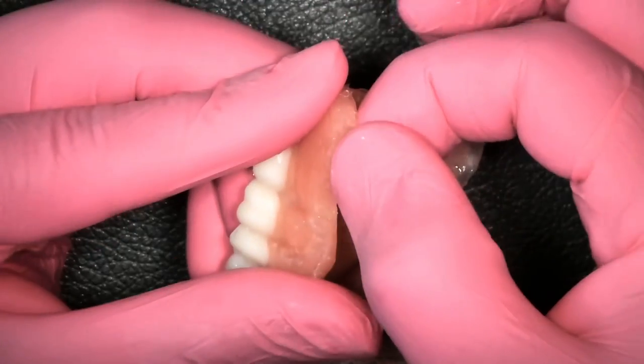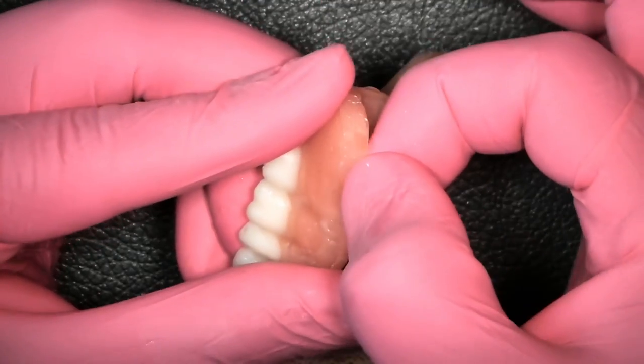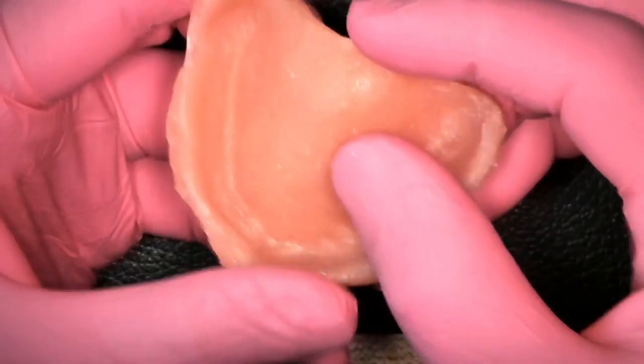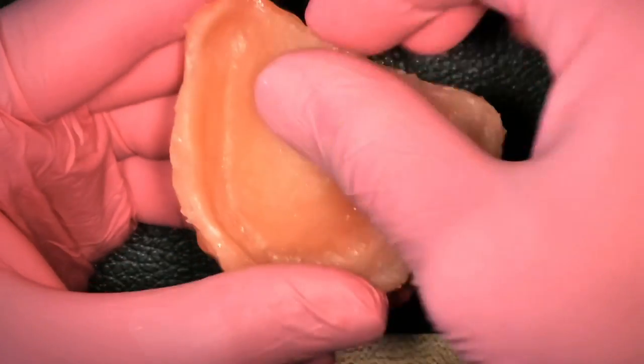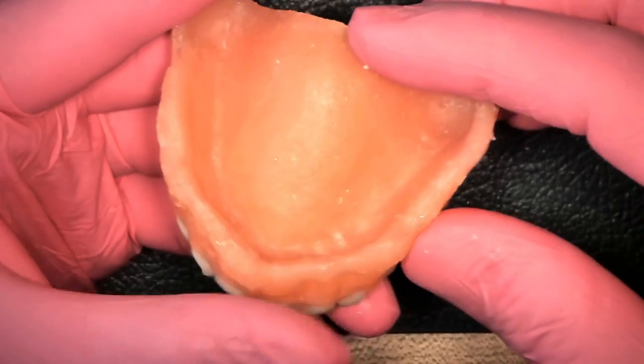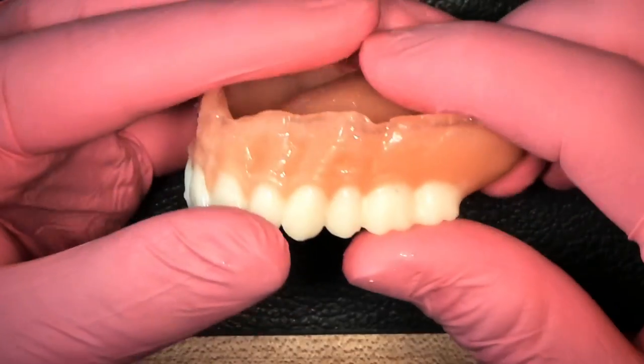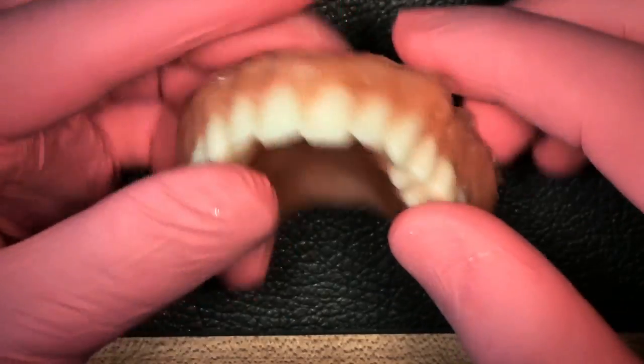So this is kind of what it looks like when it's done. You could try to peel it off, it's very hard to remove. I usually say to patients these last about one or two years and then we slide them off and do a fresh one and patients seem to be okay with that.